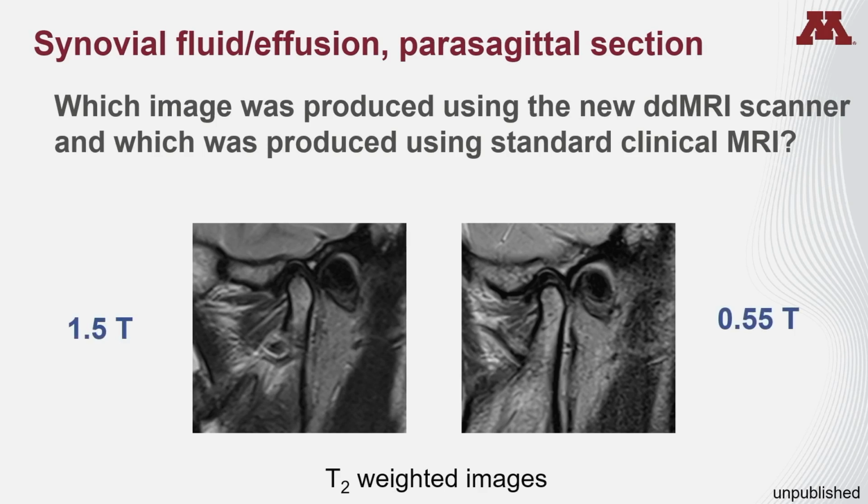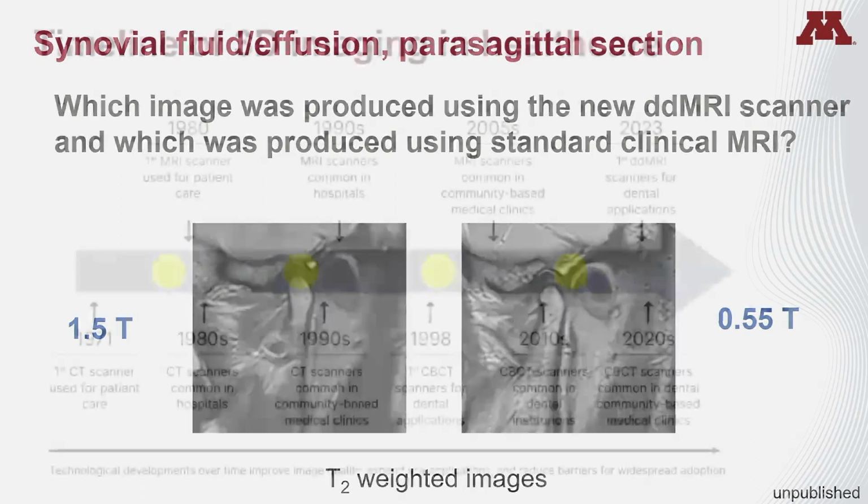And so this is unpublished research, but we went with our gold standard neuroradiologist who does this for a living. He could not tell the difference between the two different scanner systems. And so maybe we're good enough.